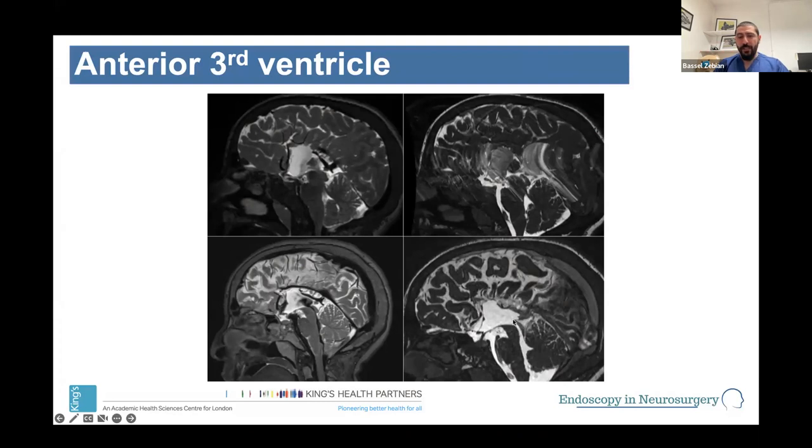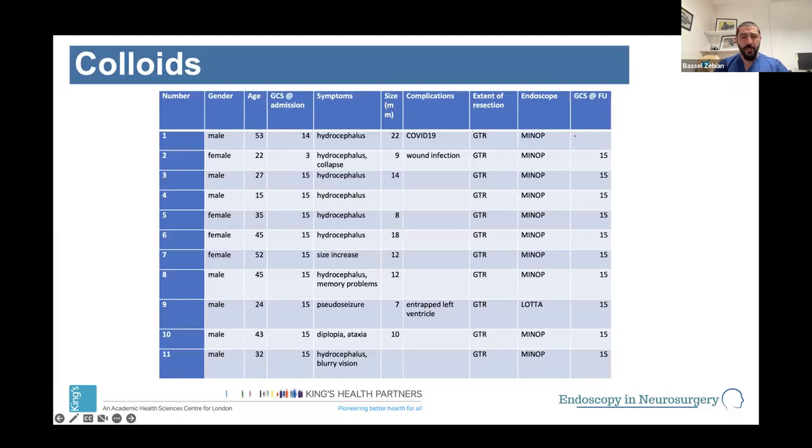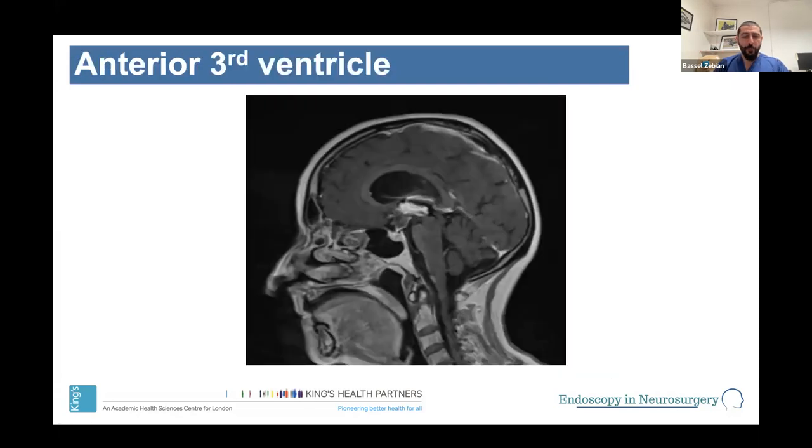But you can at least see that the cyst sequences show that we've removed the whole cyst. This was a 3 centimeter cyst in a child. We won't go through more now. We're on 14, 15, I think, endoscopic ones.